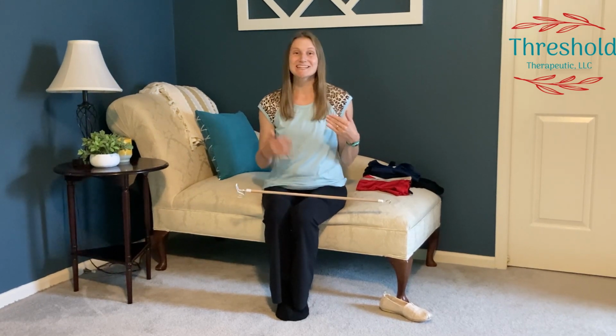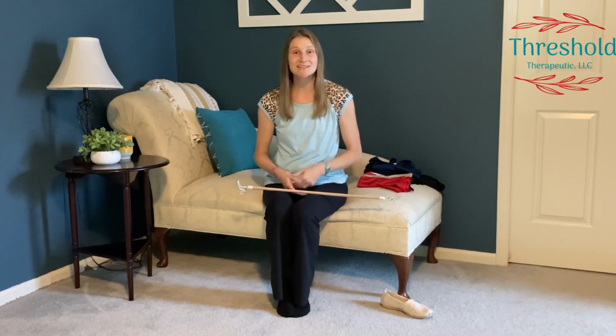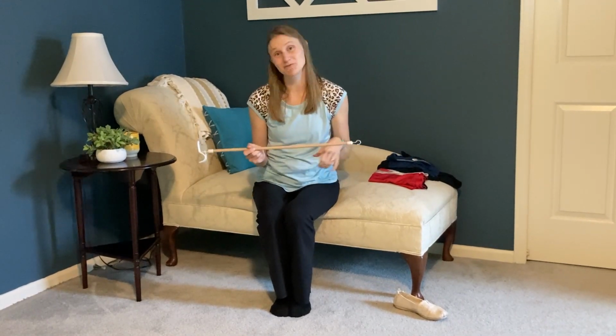Today we are here to answer the question of the day, which is, what is a dressing stick? A dressing stick is actually a stick that helps you get dressed. It has a number of uses to help you with getting items of clothing on for both your upper body and your lower body. Let me go ahead and tell you about the different components of your dressing stick.